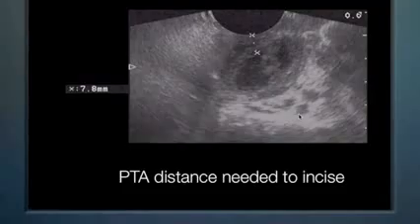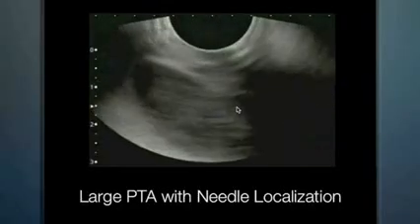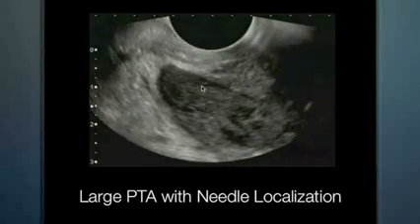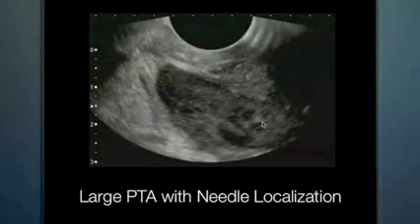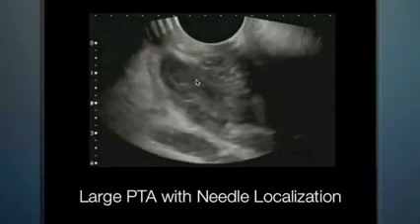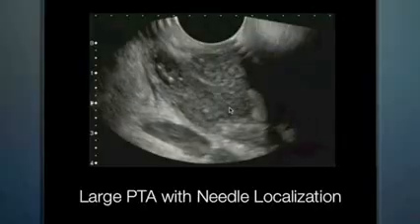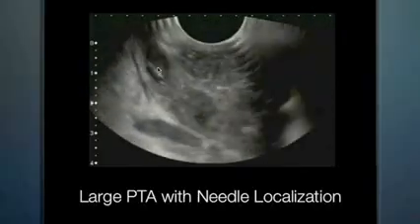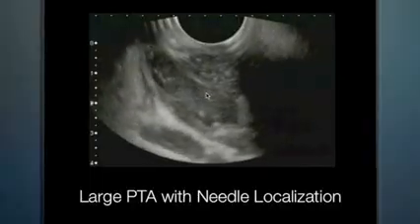And this is a large peritonsillar abscess. We can see it extending all the way down here. As we compress the back of the throat, we can see this is all pus. As it moves, as we compress it, it swirls around a little bit, and being able to see this very large amount of pus is very helpful.